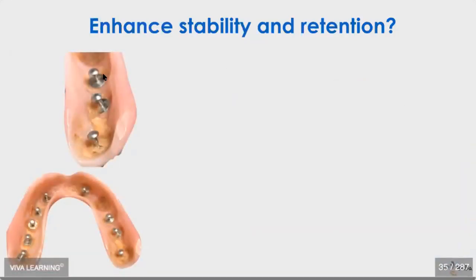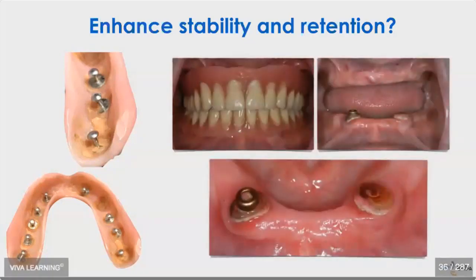Some other people have used these little pins, and I think these are kind of a torture for the patient. Well, the principle of these is that it creates some irritation, which causes the gums to swell and hook up around these. This is really a torture.